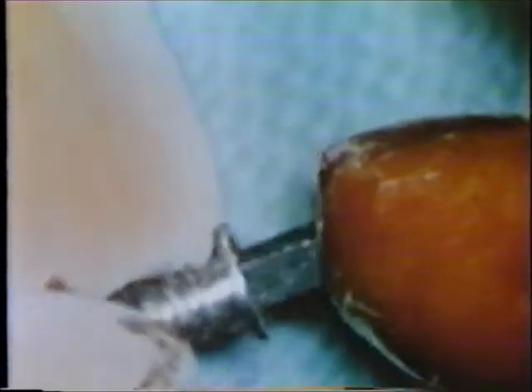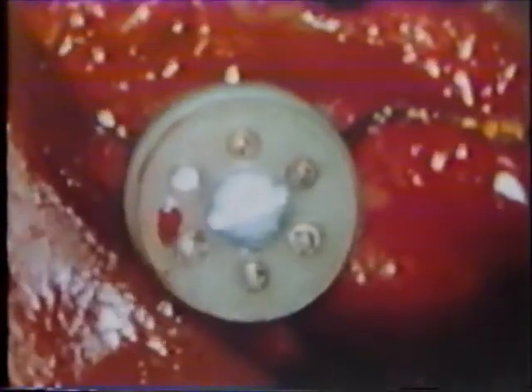A hole has now been placed in the mastoid tip, and this will accept a stud. The stud has a square top that accepts the electrode button, which will extend out through the skin. Each of the electrodes has a separate receptacle or socket so that we can introduce individual electronic circuits to each of the electrode endings. We cover this entire button with a screw-on cover that can be kept in place after the healing has taken place.